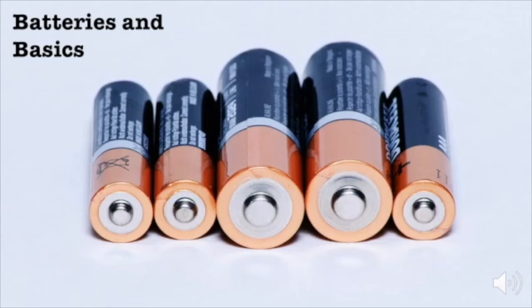Some of the other alarms are more complex. Even as a doc, I'm going to struggle to fix some of these in the hospital. Just for exposure, though, I'd like you to be aware of some of the things the LVAD alarm might say. You might see something on there such as high flow/low flow error, high power errors, low PI errors. And again, this isn't going to be solved by us on the scene, even under the best circumstances. If we're lucky, we can stabilize the patient until we have enough time to get them to an LVAD center for these issues to be solved.